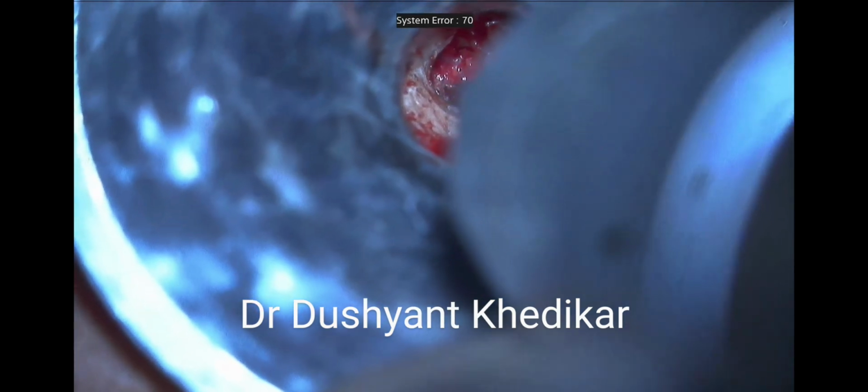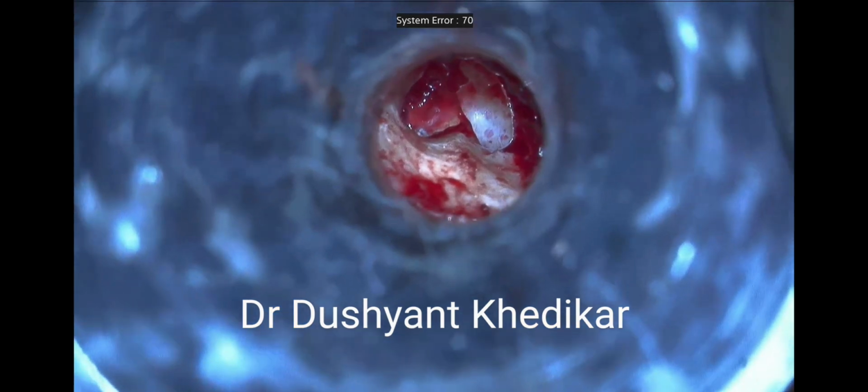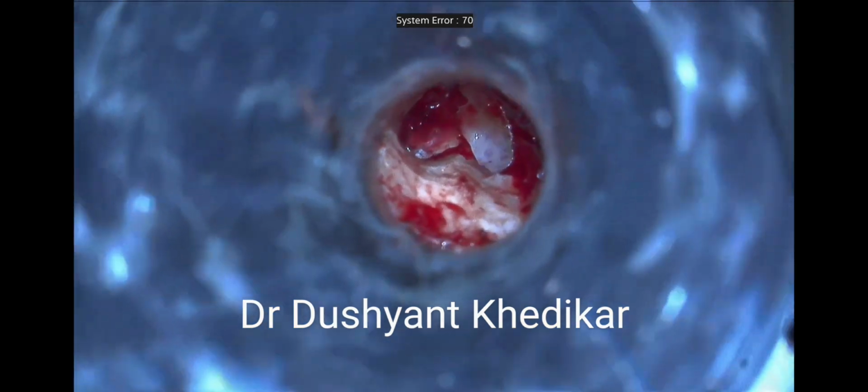In today's surgical video, I am demonstrating the surgical principles of the management of obliterative otosclerosis. This is the stapedotomy surgery of the right ear. The tympanomeatal flap has already been elevated and the bony posterior superior canal wall overhang has been curetted out.